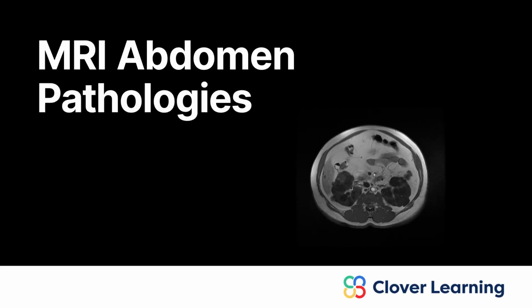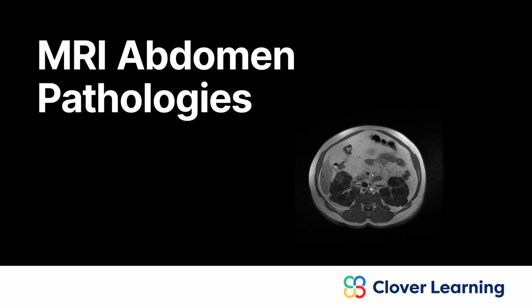Hey everyone, welcome to today's lesson on common pathologies associated with an MRI of the abdomen. In this lesson, we will discuss characteristics of routine pathologies seen on these types of scans. It is important to remember there are many pathologies associated with the organs of the abdomen. These are just a few common ones a technologist should be familiar with.